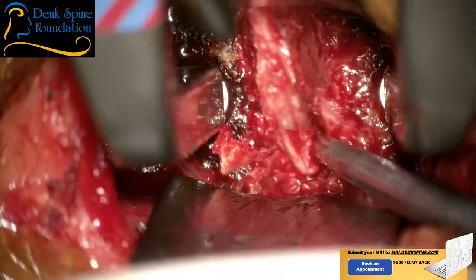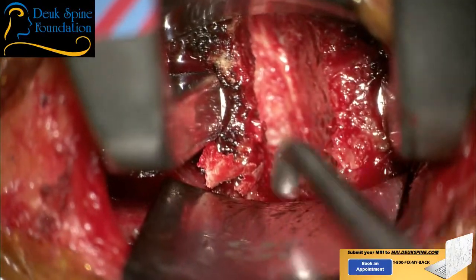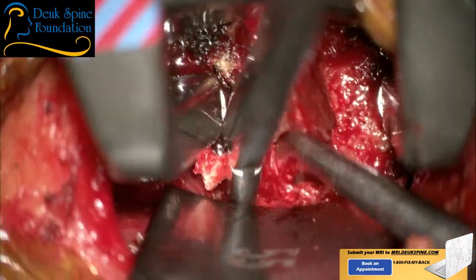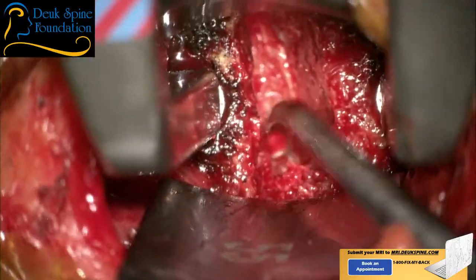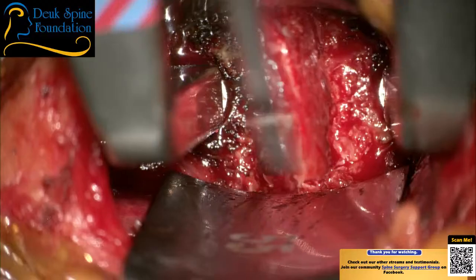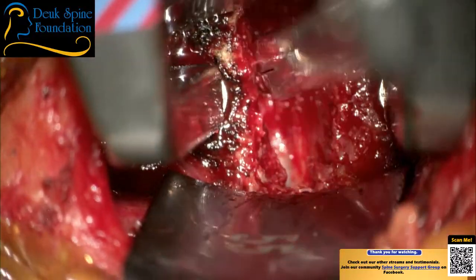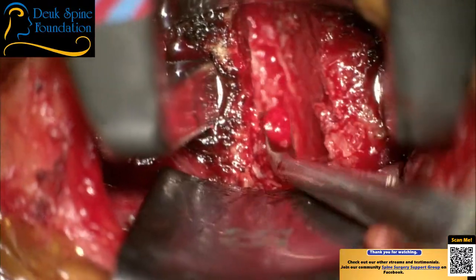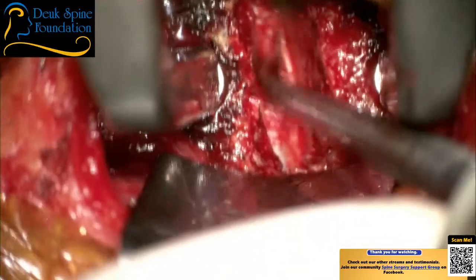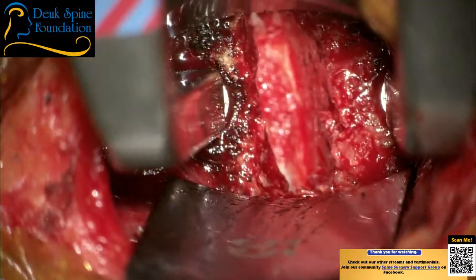Okay, here's all pieces of cartilage. Now, why do we remove the cartilage? Because we're fusing these bones. You can't fuse two bones that have cartilage still on them. So part of prepping the bones for fusion, I'm being aggressive in removing all the cartilage, okay? This is all inflamed and scarred back here. A lot of inflammatory tissue from the injury, the herniation. Herniations cause inflammation. That's how the body heals the herniation. The problem is it doesn't always work. Then we have to do surgery.